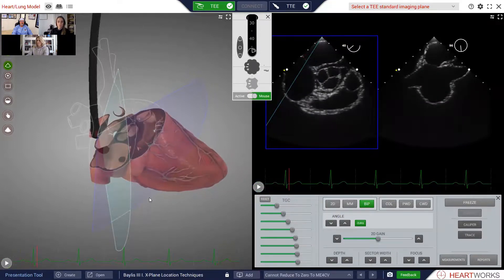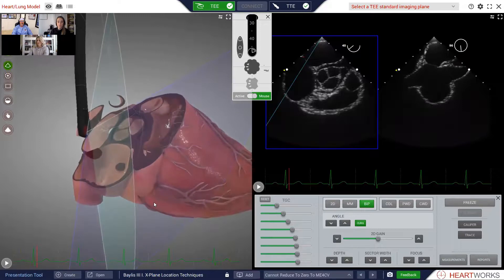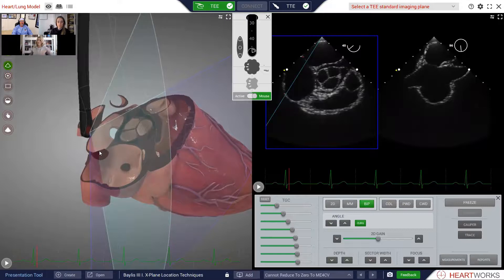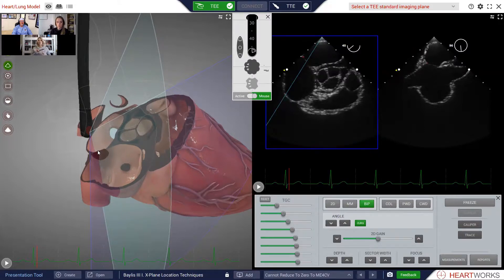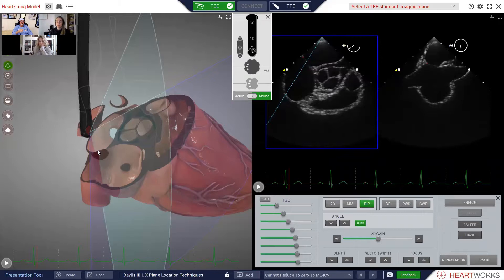Let's say that we had tenting right at the intersection of the two planes, so it would show up on both the primary and the secondary plane. And let's say it was a mitral clip case and now we wanted to measure the height above the mitral valve in the four-chamber view. What could we do without losing both views of the tenting? How could we develop the four-chamber view without losing our short axis view, which is the primary view? What could we do, Jody?